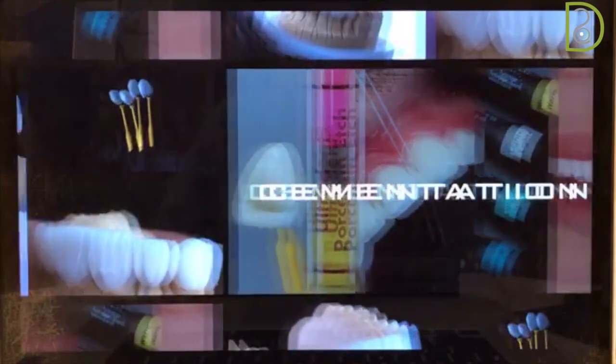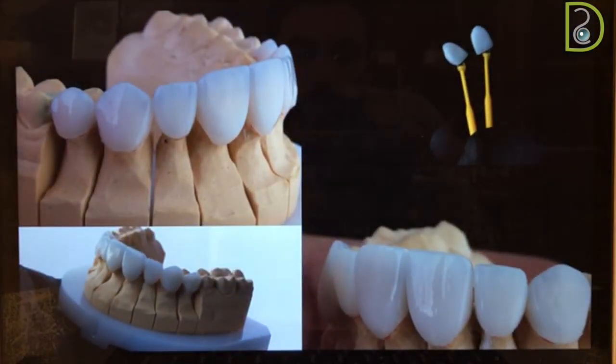Now, the most important fact over here, guys, is that regardless of the effort you put during preparation, temporization, and final impression, failure occurs with big chances if you didn't pay attention to the cementation steps and didn't give it much attention while performing that step exactly.